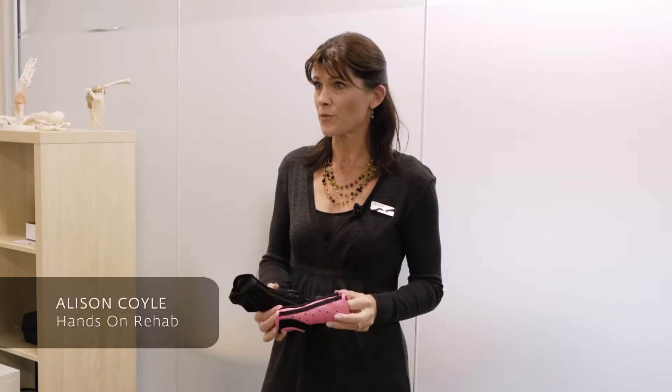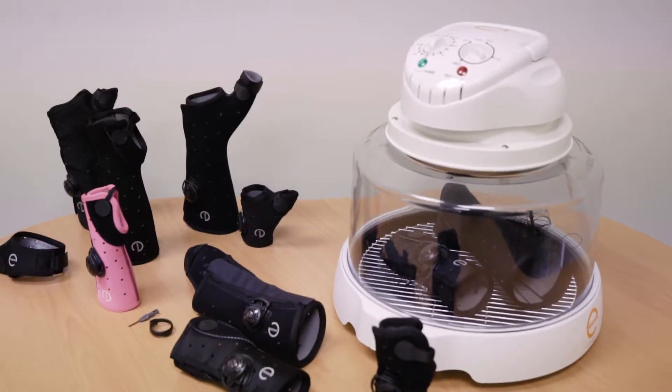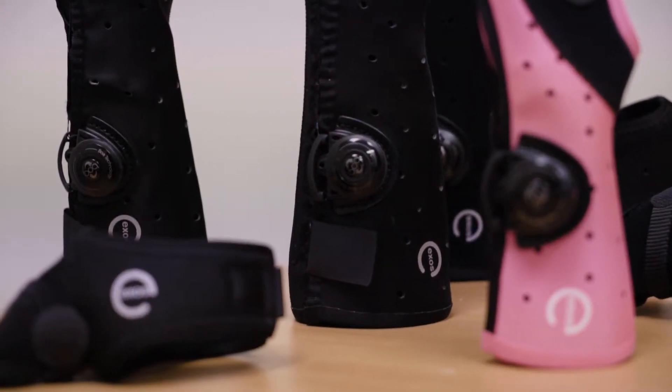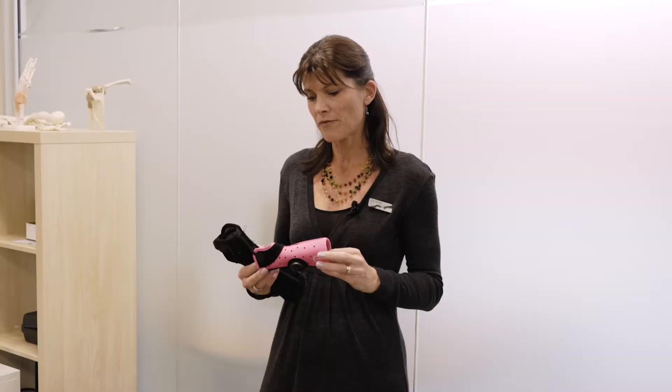I'm Alison from Hands-On Rehab. I just want to talk about these products that we're using at the moment as an alternative to casting. We use them for pediatrics and for adults because we have a variety of sizing and they're a really good option instead of a plaster cast or a fiberglass cast, particularly for the little ones with wrist fractures, buckle fractures of the distal radius.